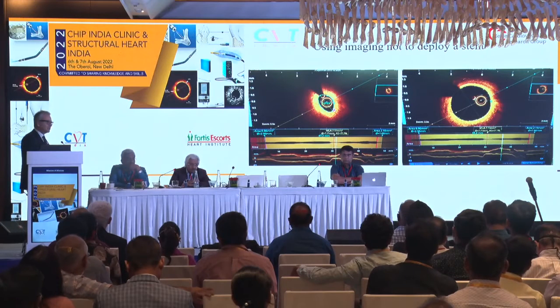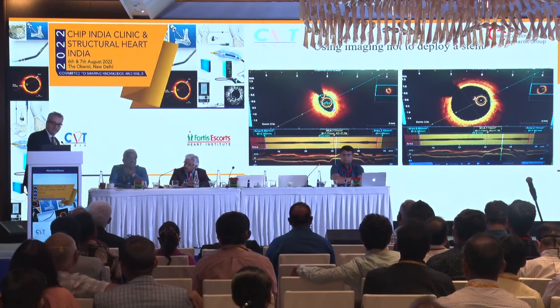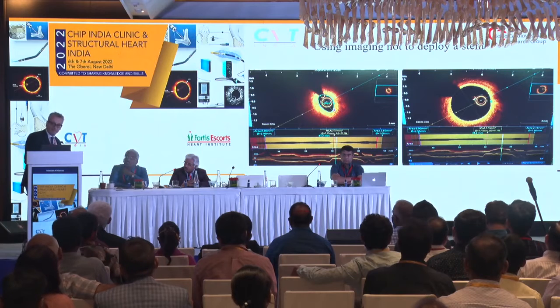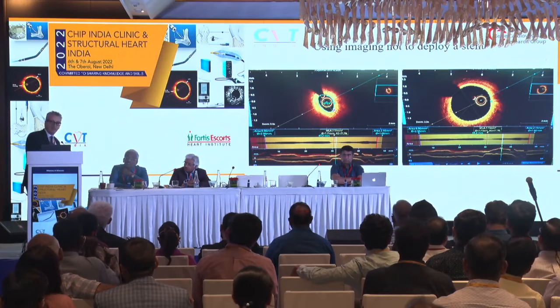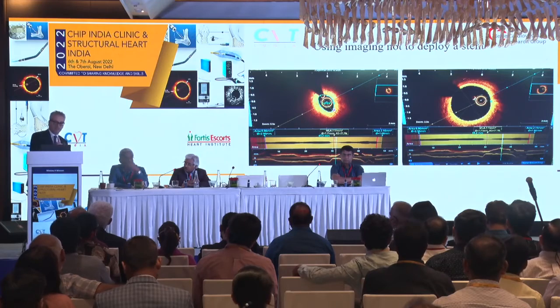This lady actually had a Takotsubo presentation because of a fine needle aspirate in her chest wall. It turned out that this lady had lung cancer. If I'd have stented this, that would have delayed her operation. Her LV recovered. A week later, she had lobectomy. She was treated with cisplatin and paclitaxel, remains well. If I'd have stented the right coronary artery, that would have been a disaster for her. So again, not a reason to stent using imaging.